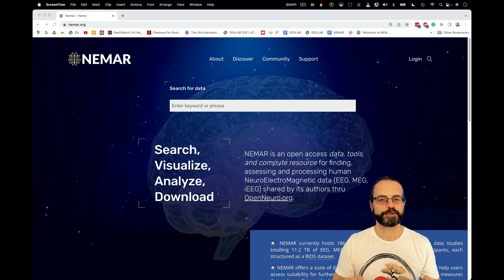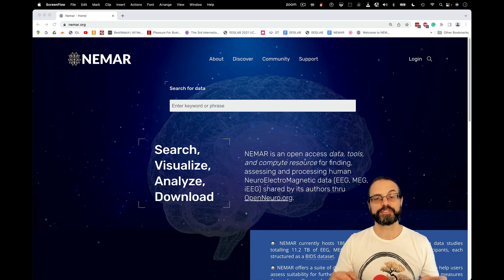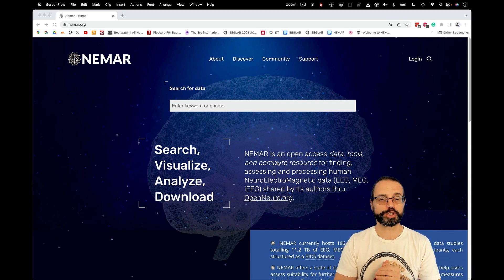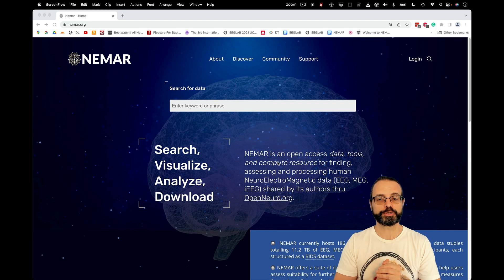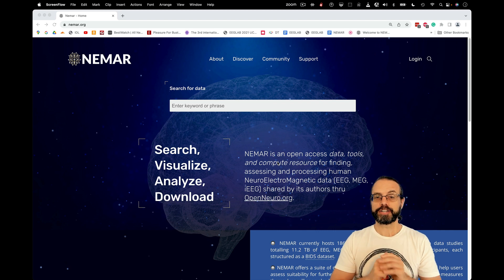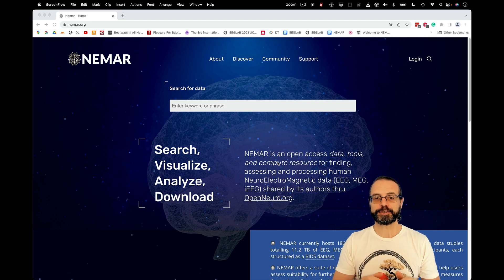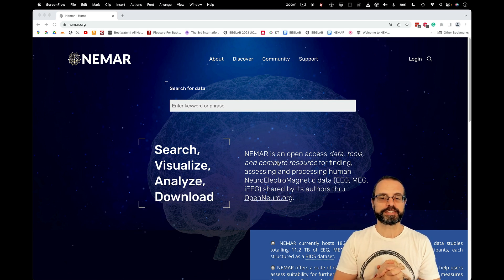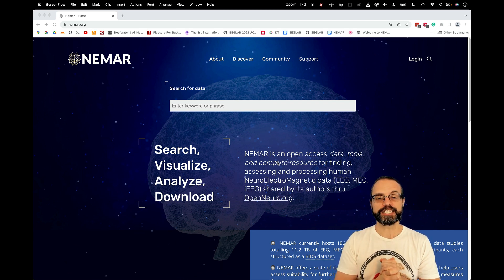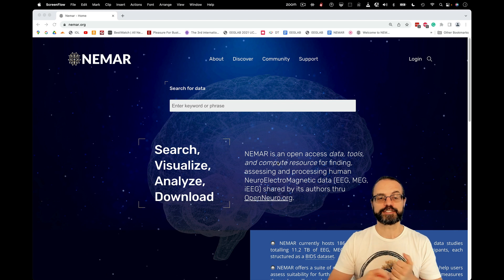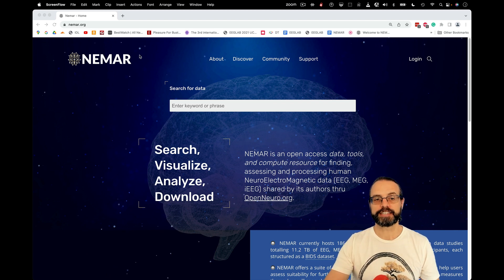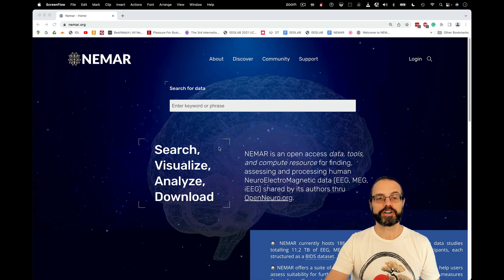Hello, my name is Arnold Delorme, and in this short video, I'm going to show you how to run some analysis on the supercomputer using some EEG datasets stored on this website, NEMAR, which we administer.